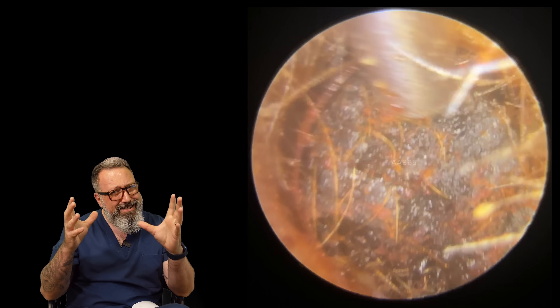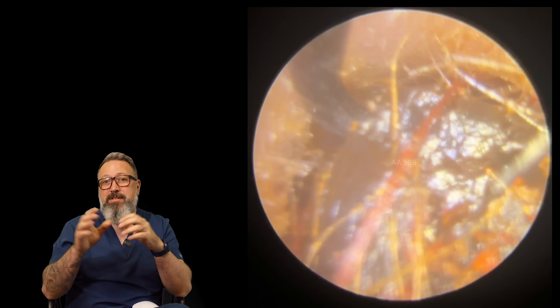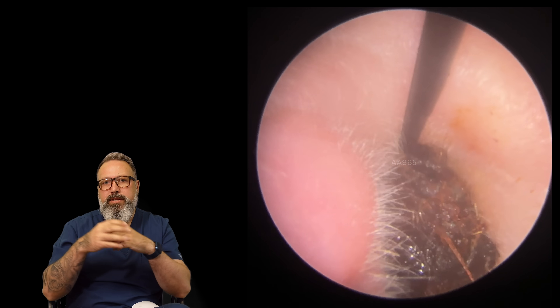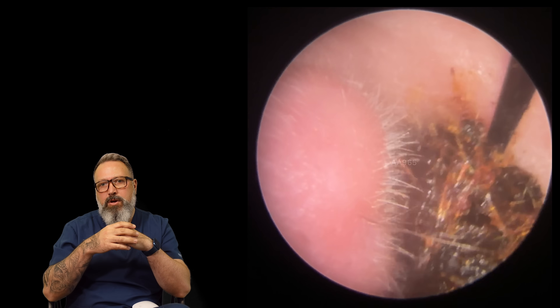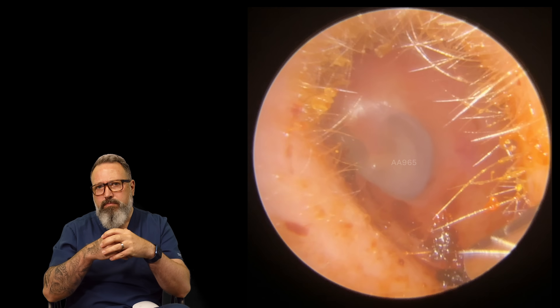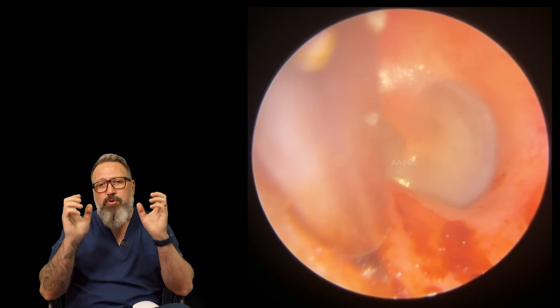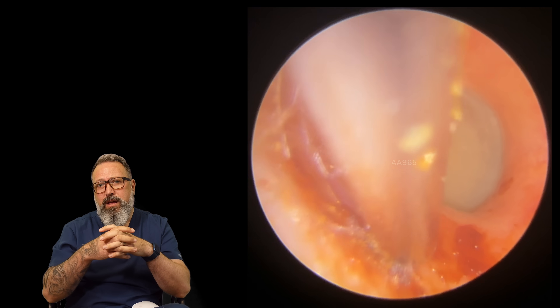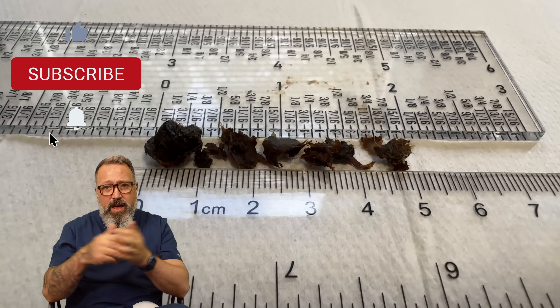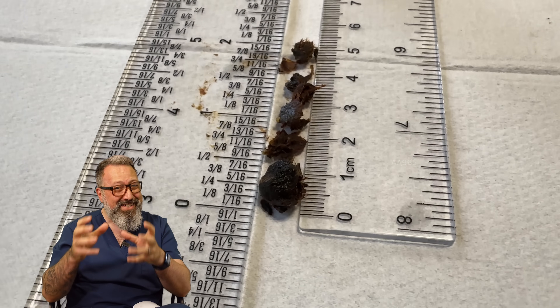It's got a little bit stuck on the outside edge, so I need to bring out the Saint Bart's hook - another curettage tool with a wide 90-degree angle, great for hooking behind the wax and pulling it out. There we go - out it comes. Look at the eardrum beyond: smooth skin, shiny, pearlescent, slightly translucent - perfectly normal. In total, five centimeters - bang on two inches - of ear wax came out of that patient, mostly from the second ear canal.